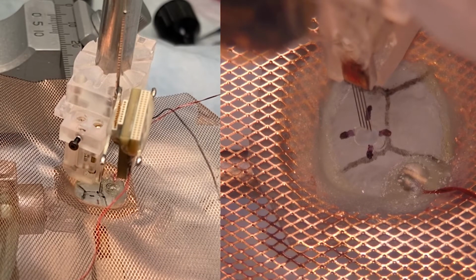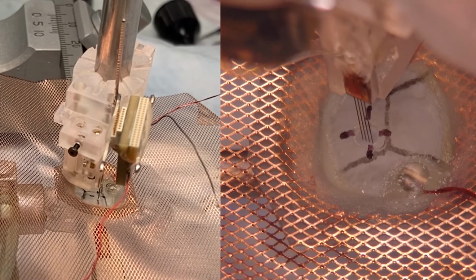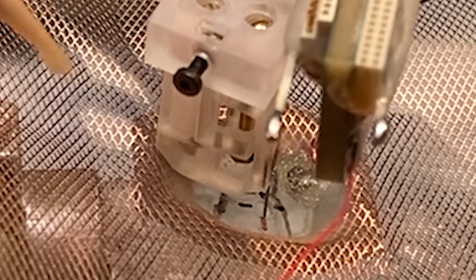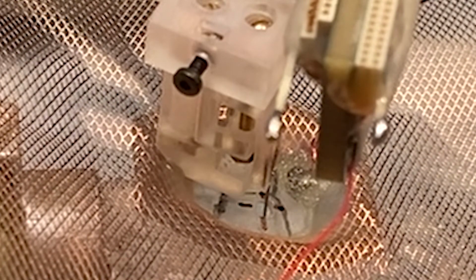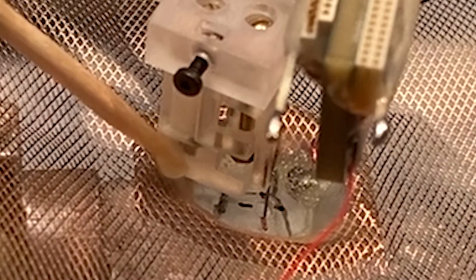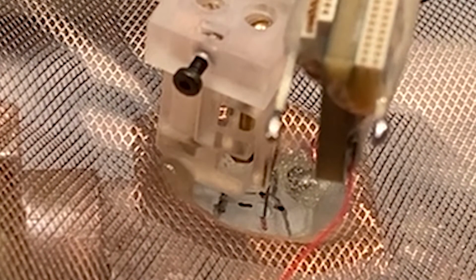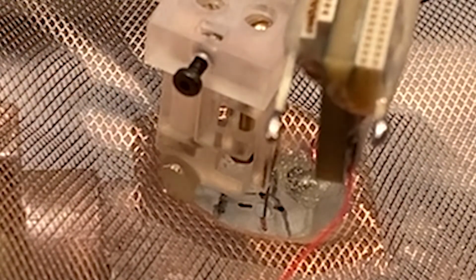And then we can just start moving down into the brain, and be extremely careful to lower your micro-LED probe at a certain position. It depends on your target location, but you don't want to bump into the plastic base with your shell component. And if you do bump into this plastic base, then you need to lower your silicone probe further down. Once you are above your target location, like 500 micrometers at least, then you can start applying cement between the shell component and the skull and the plastic base.